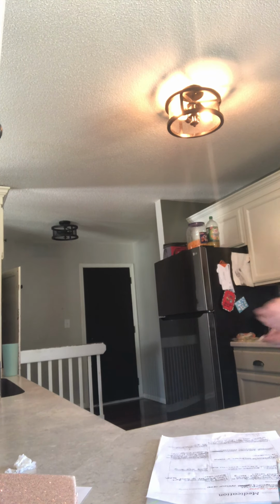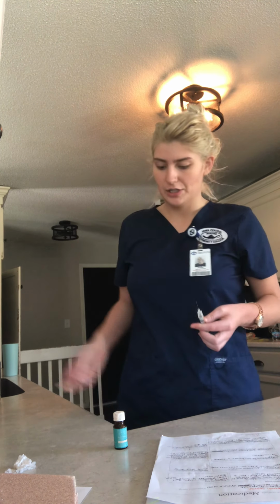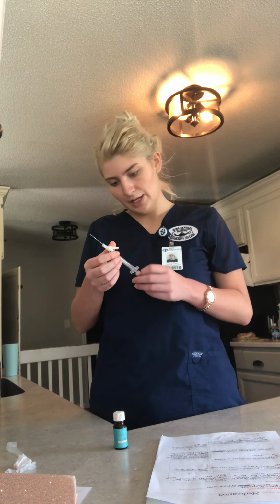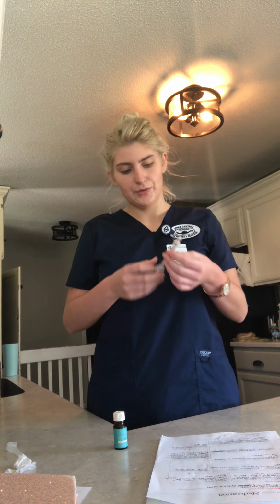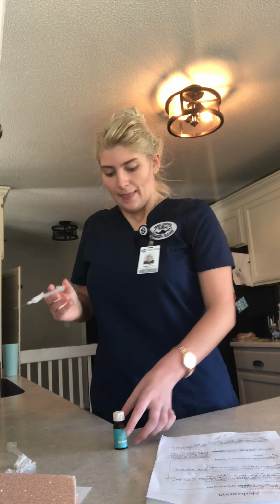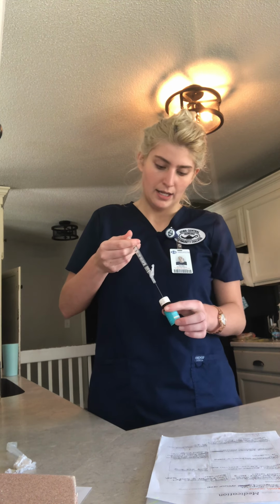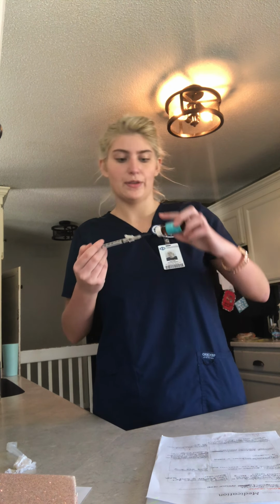After you clean that off with rubbing alcohol, you can take this apart and you need to inject air into your vial. The air that you inject is the same amount as your medication dosage. My medication dosage is 0.1 ml, so I need to pull back my syringe to 0.1 ml. And then stick it into the rubber part of the vial, inject it, and turn the vial upside down with the needle still always in the rubber.